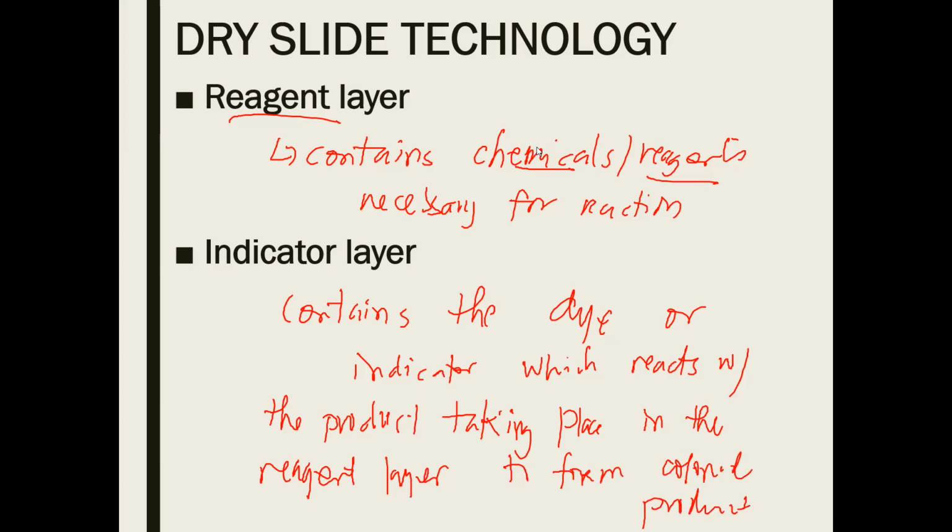Yan. Ito po yung sinasabi ko sa inyo. Bakit? Ang ating dry chemistry is based on the reaction color. Okay? Photometric, based on the reaction color. Okay?